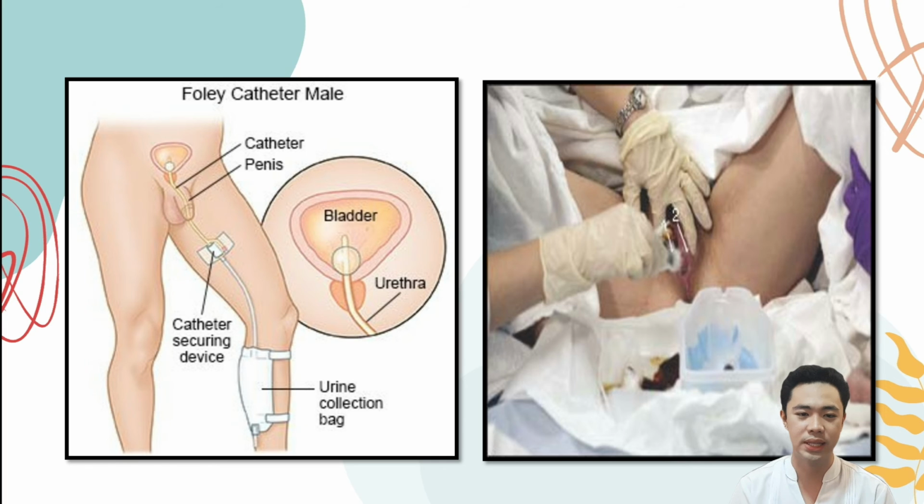Open the catheterization kit. Place a waterproof drape under the buttocks of a female or penis of a male without contaminating the center of the drape with your hands. Apply sterile gloves and organize the remaining supplies, such as saturating the cleansing balls with the antiseptic solution. Open the lubricant package. Remove the specimen container and place it nearby with the lid loosely on top.